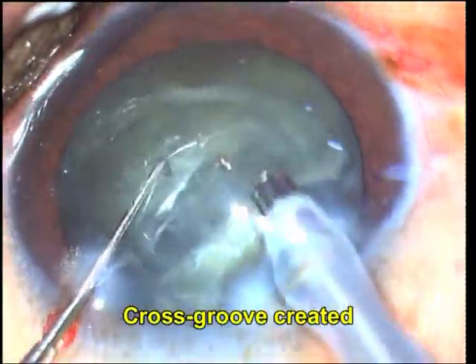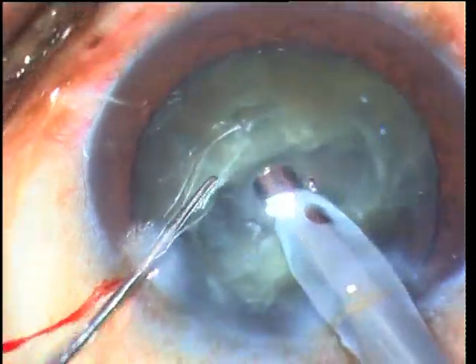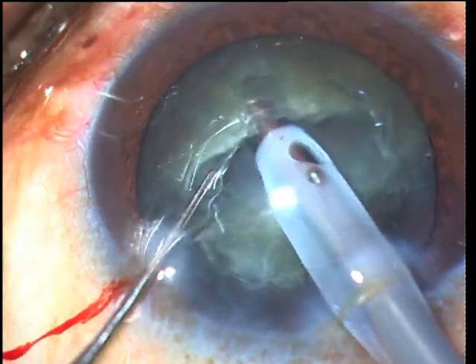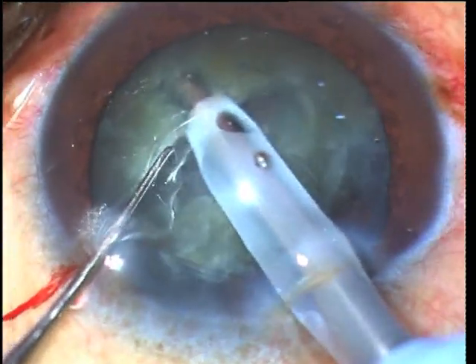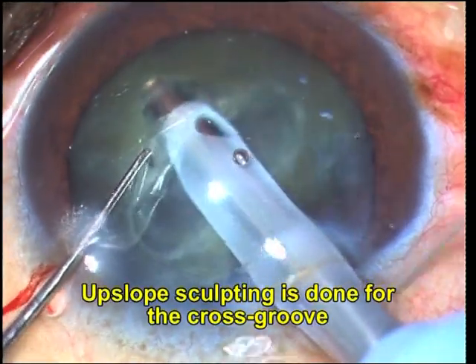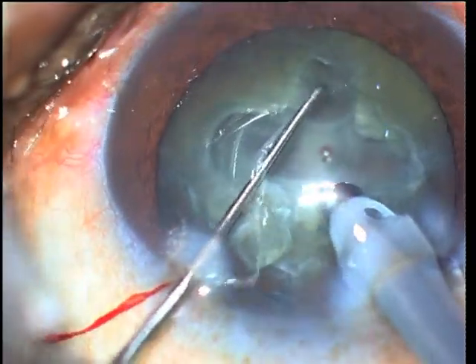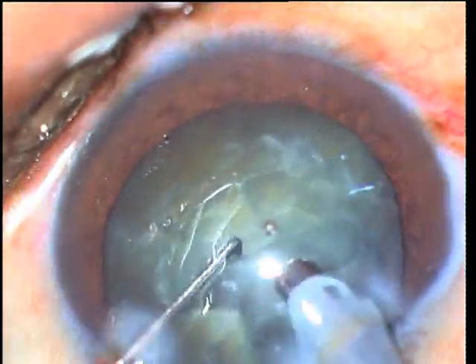The cross groove is created in a similar manner, about 1.5 phaco tips wide and about 3 phaco tips deep, so as to see a clear red reflex. Since the center of the nucleus has already been crossed, only upslope sculpting is performed. A longer lever arm eases rotation, and therefore less force is required when the second instrument is placed in the periphery of the groove rather than in the center to rotate the nucleus.